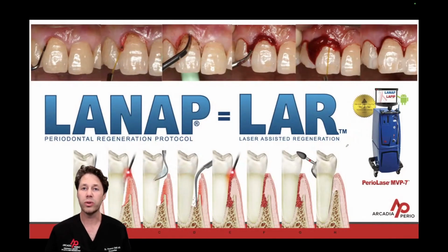We're going to treat this tooth with the LANAP protocol isolated to a site-specific area. I want to walk you through the protocol and what that looks like quickly so you get a better understanding of how this laser treatment works in my office and works in my hands. First, we're going to do our bone sounding probe depths under local anesthetic. We do this because the bone sounding probe depths allow us to determine how much energy is needed for that site-specific area.